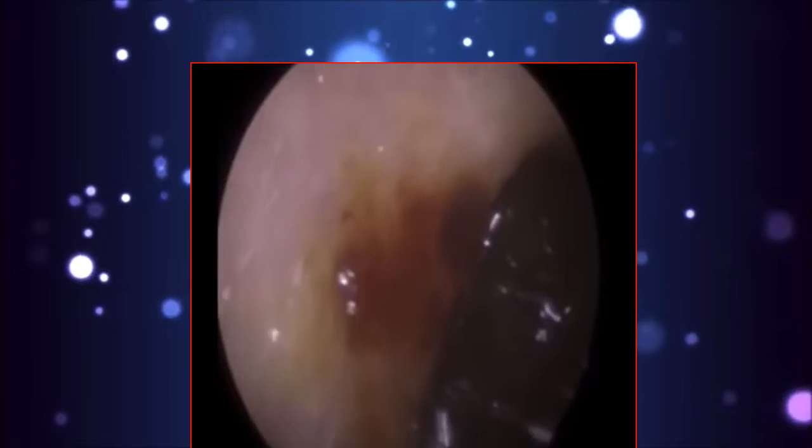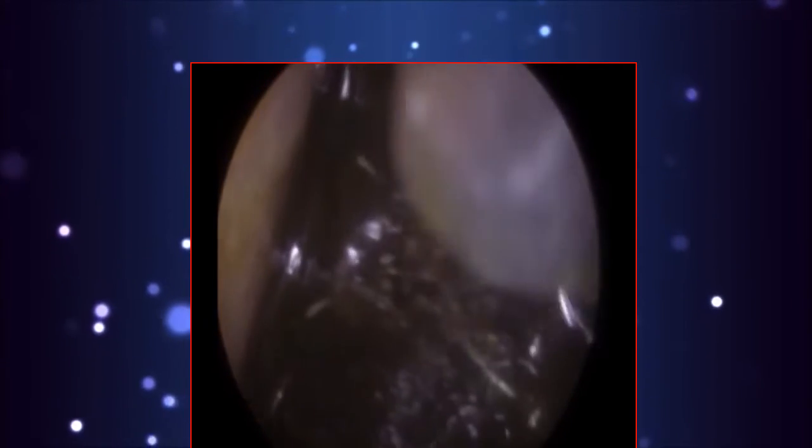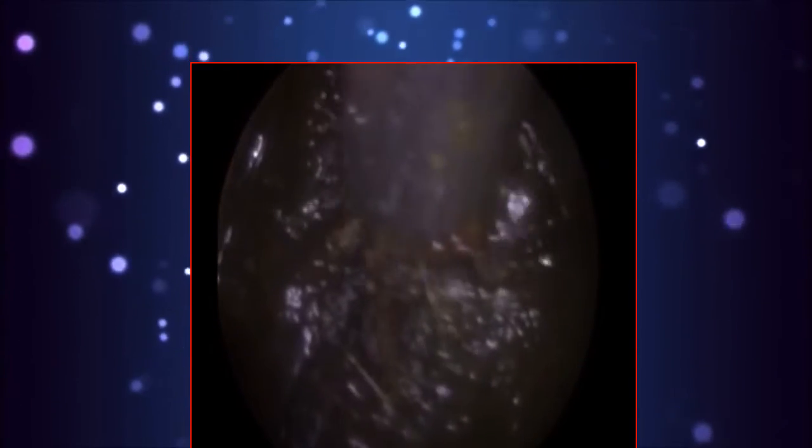You can see how blocked it is. It's fully occluding. It's completely created an airtight acoustic seal around the ear canal. So I've just instilled some olive oil earwax drops and immediately it's changed the consistency of the earwax. It's not blocking the suction tube, or not blocking it as much.